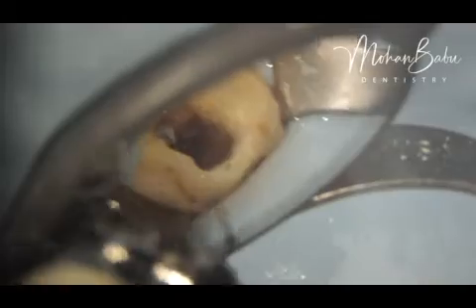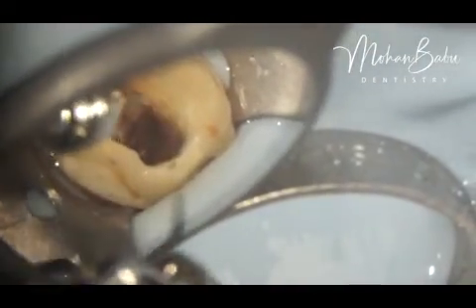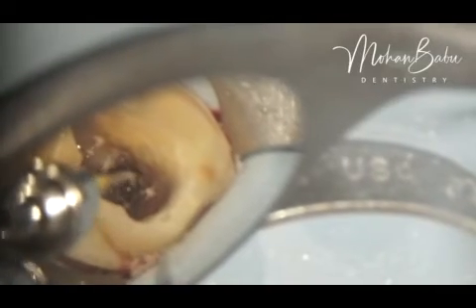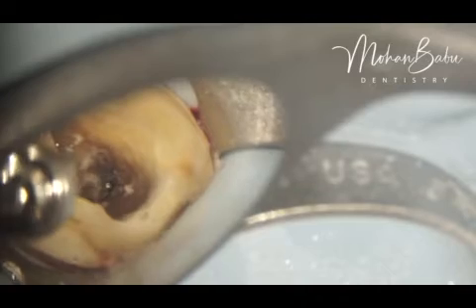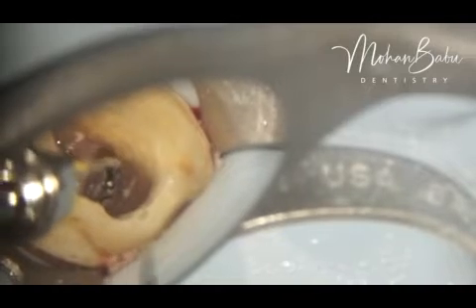There was some GP material beside the instrument. We enlarged the coronal portion of the canal a little wider so that we can see the instrument more clearly. After doing this, we created some space around the fractured file with the help of the U-file.